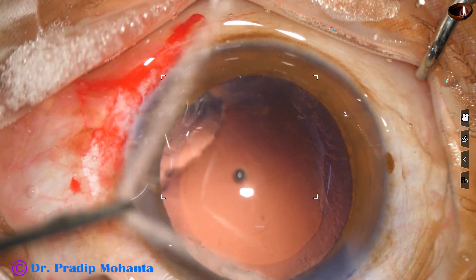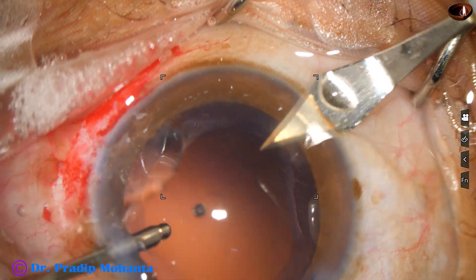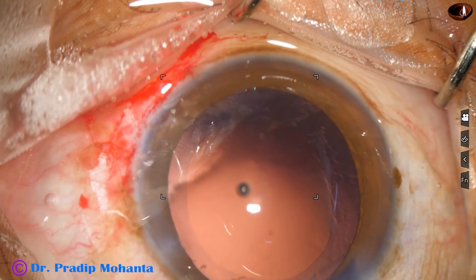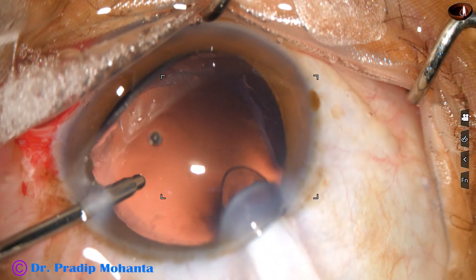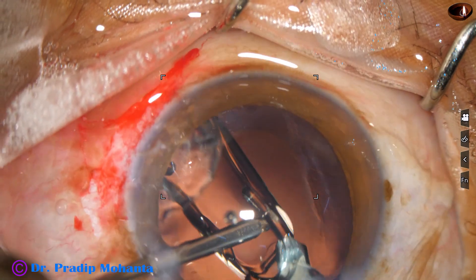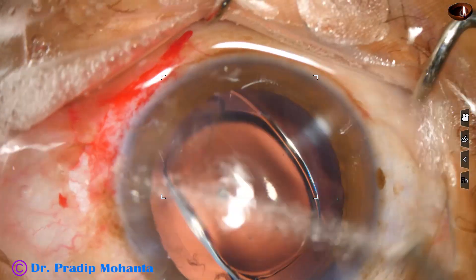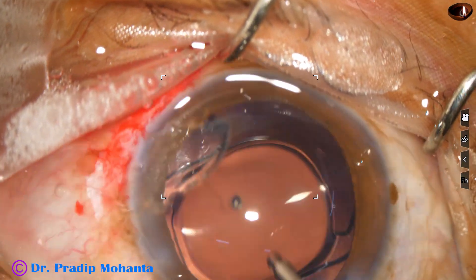Now is the time to implant an intraocular lens. I made a side port at around 8 o'clock, and then the main wound. Implanting the intraocular lens, keeping the anterior chamber formed by irrigation. This is a hydrophobic acrylic single-piece monofocal intraocular lens. The lens is in the capsular bag.